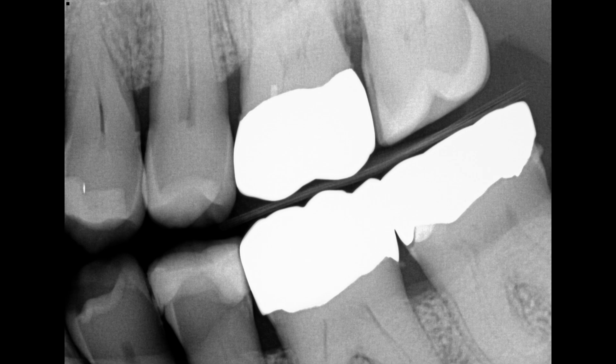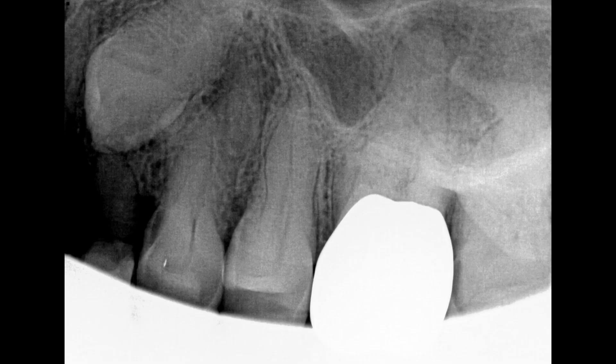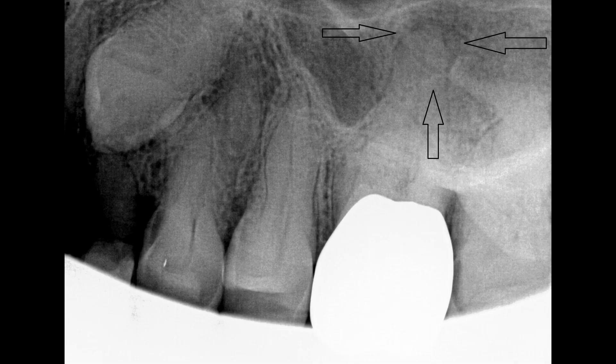The X-ray kind of looks a bit funny, weird presentation. The PA shows that there's actually a lesion on the 2.6 that we made a plan to do a root canal for, but in this one we're just going to be doing the MO on the 2.7.